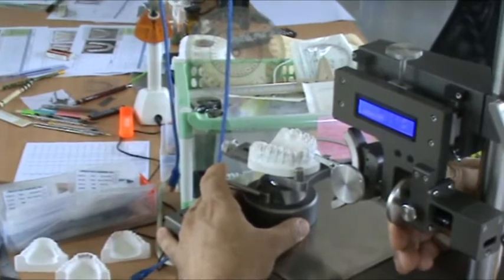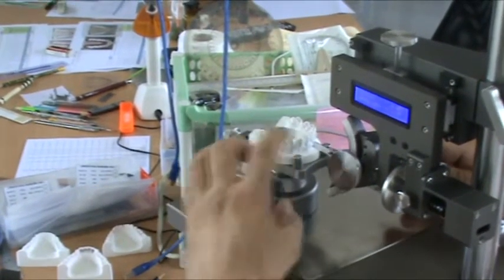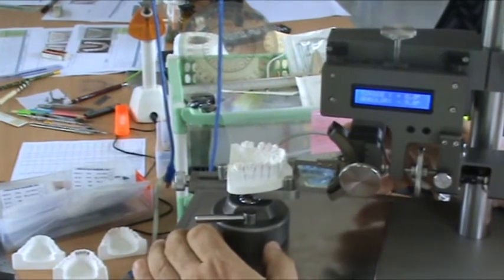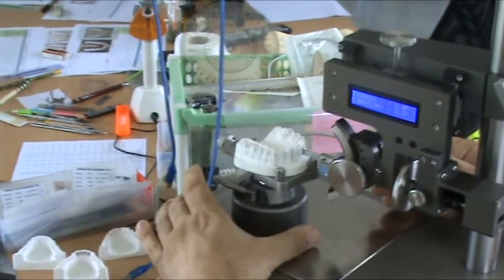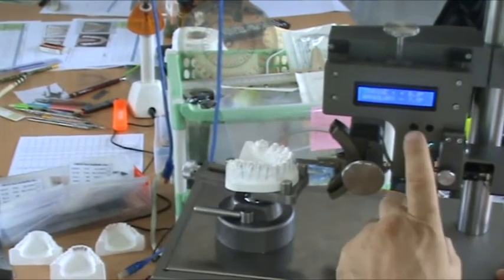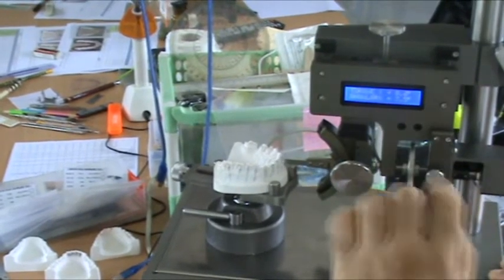to make sure that I'm measuring correctly, positive or negative. If the blade is leaning towards the midline at the top, it's positive. If it's leaning away, it's negative tip angulation. But when I come to the other side of the arch, now it's wrong. It's leaning away, it's positive. Leaning in towards the midline, it's negative. So we just press this button and it changes it. Just one press, not hold it, just press.